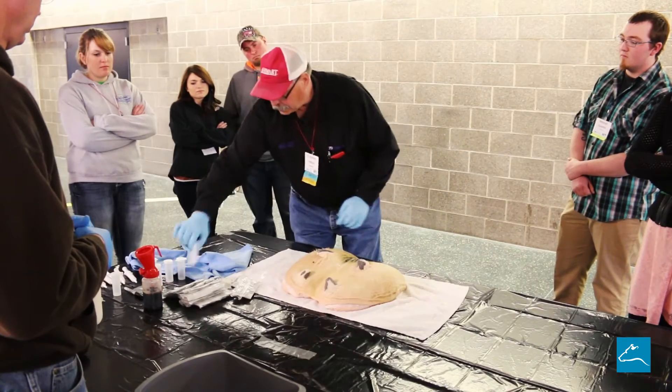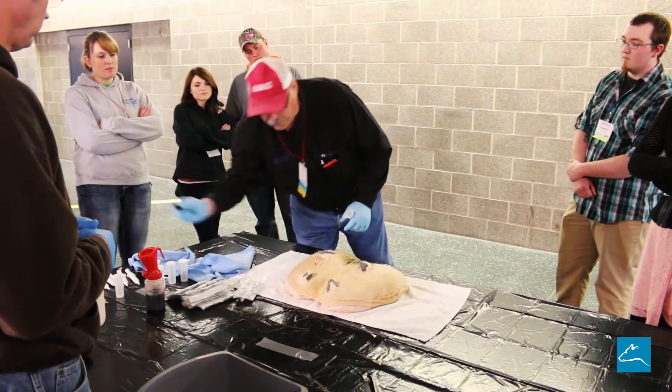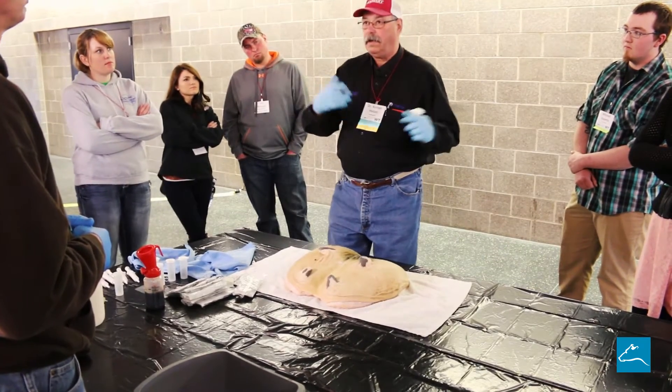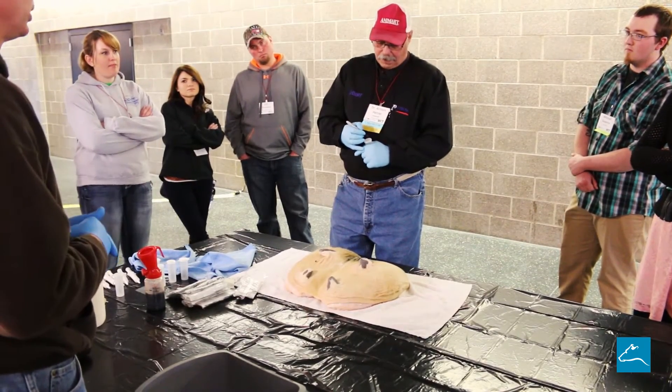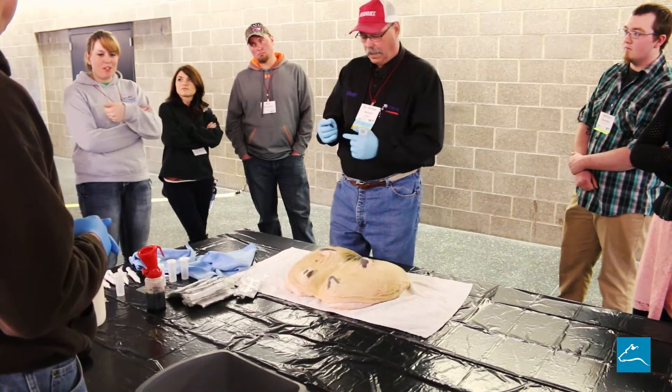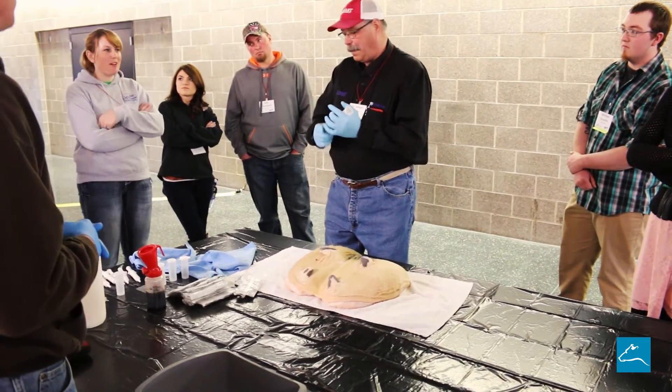Then we take our culture. The first thing we do before we get our culture is write the name down, because after we get our culture our hands are wet. The vial is probably going to be a little wet. Get the vial, put the number on. I've learned that if you have alcohol on your hands, don't touch your writing, because it'll rub right off.